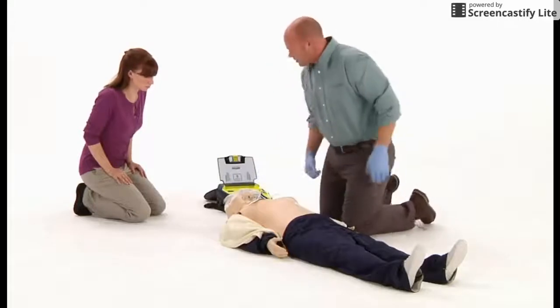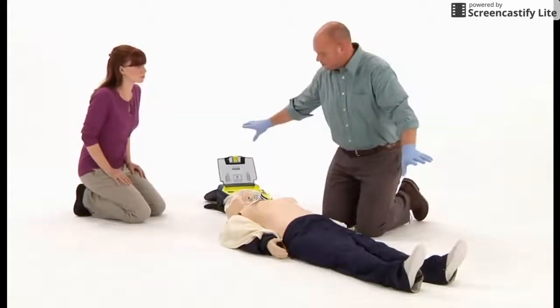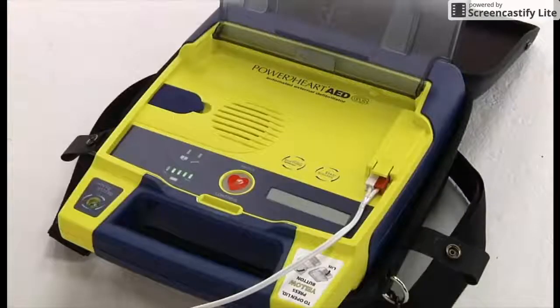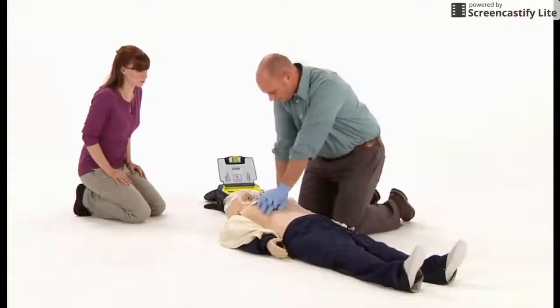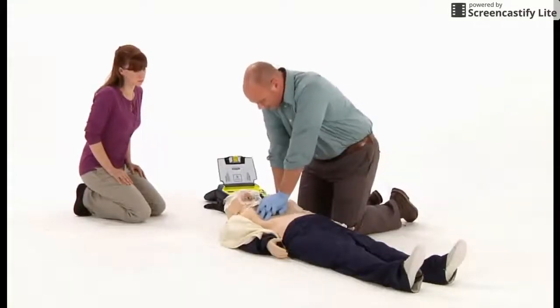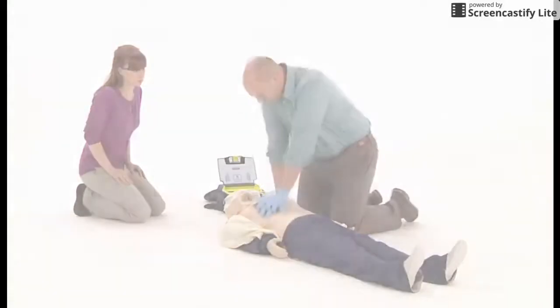Do not touch patient. Analyzing heart rhythm. Continue to follow the prompts of the AED and provide care as needed. It is now safe to touch the patient. Start CPR. If at any time you notice an obvious sign of life, such as breathing, stop CPR, maintain an open airway, and monitor for any changes in condition.